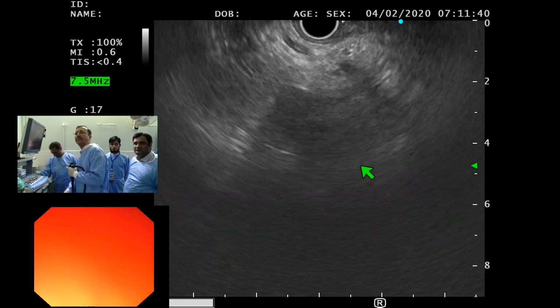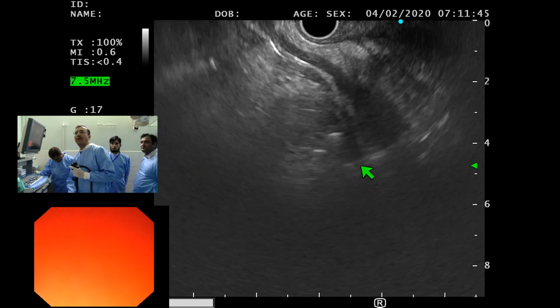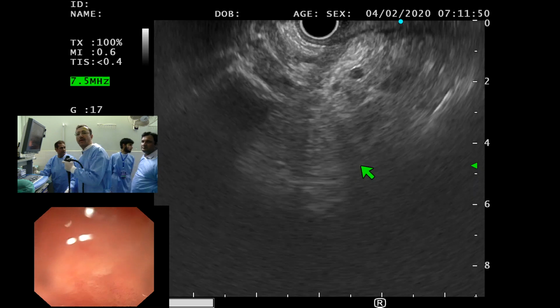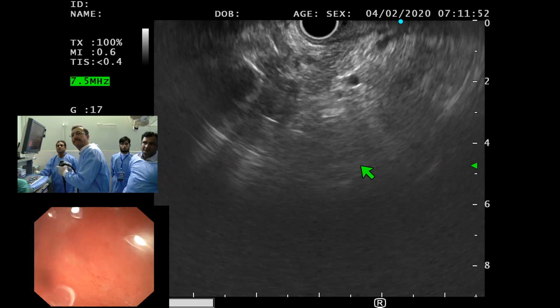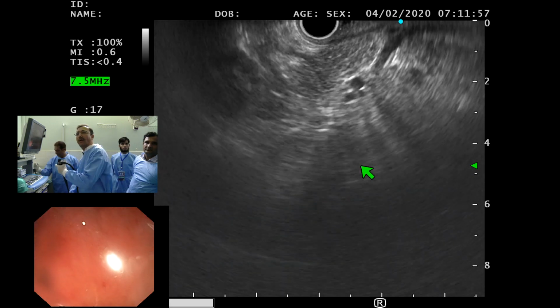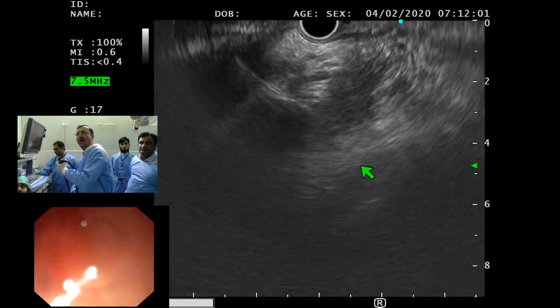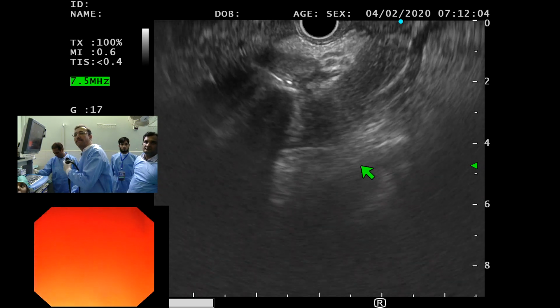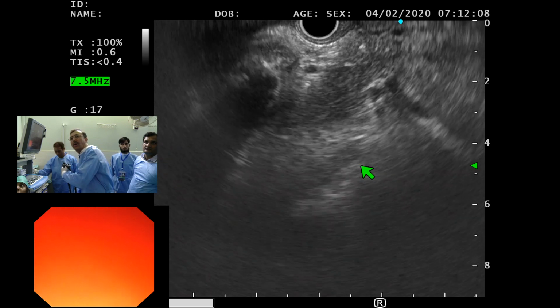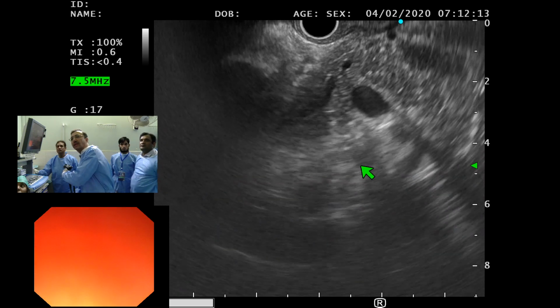Yeah, there may be something. Except that lymph node that we had seen, I don't find any other abnormality.